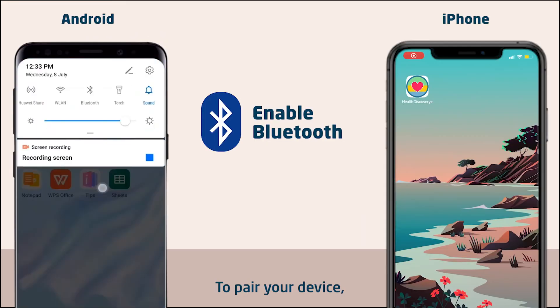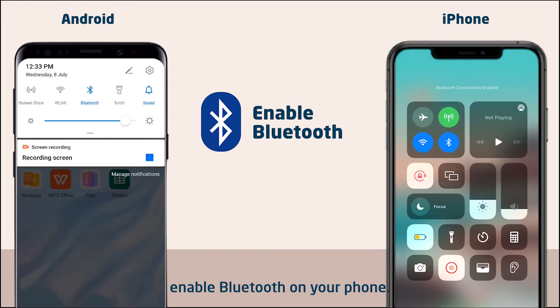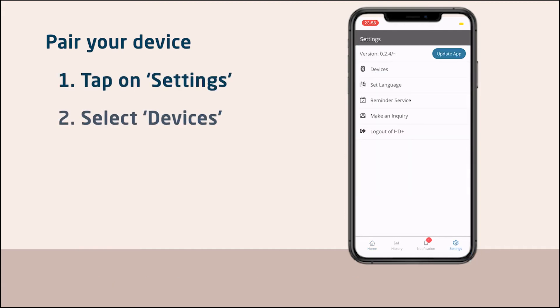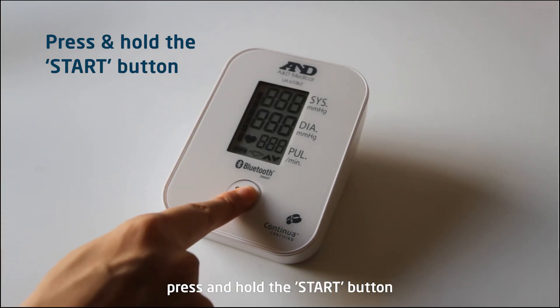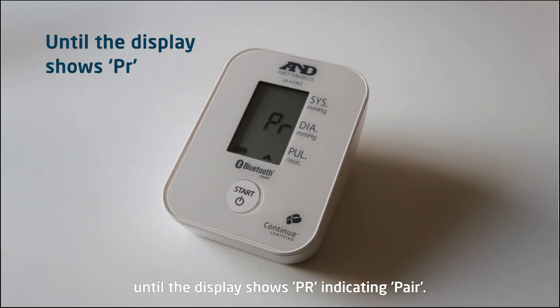To pair your device, enable Bluetooth on your phone. Tap the Settings icon on the bottom right of the app's homepage and find Devices. Select your A and D BP machine. On your BP machine, press and hold the Start button until the display shows PR, indicating pair.